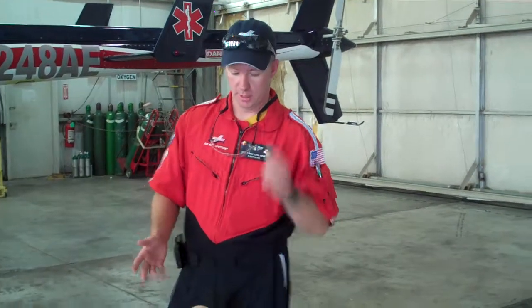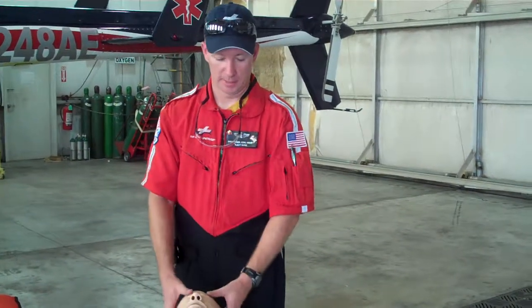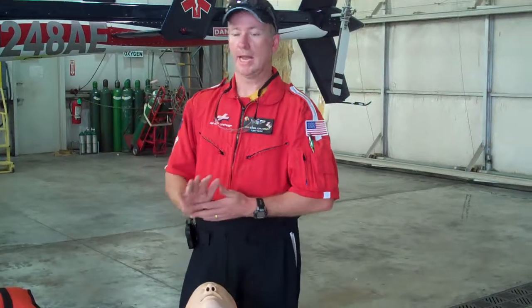Okay, so we've looked at bag valve mask ventilation of a patient in a non-emergent situation. We've demonstrated a very basic intubation at the bedside. So what can happen, and we're going to talk more about it in a pre-hospital setting, we have two options that could happen if we can't get the patient intubated.